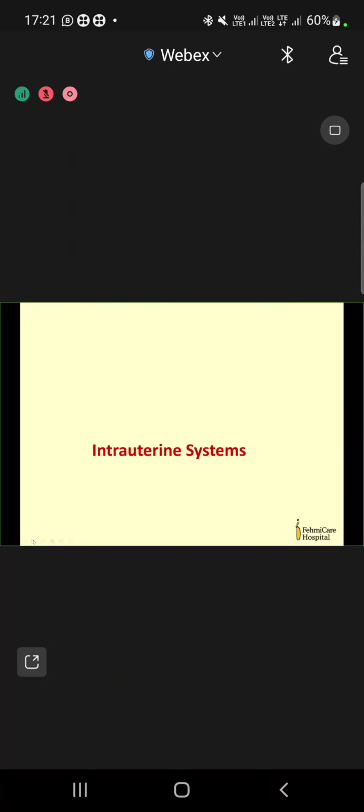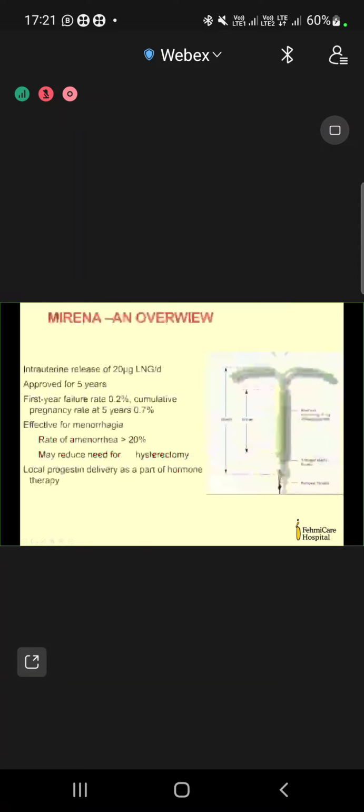Coming to the other conservative procedures, we will discuss intrauterine systems. As all of you are aware, Mirena has become very popular. It is an intrauterine releasing system of levonorgestrel. It releases 20 micrograms of levonorgestrel per day.